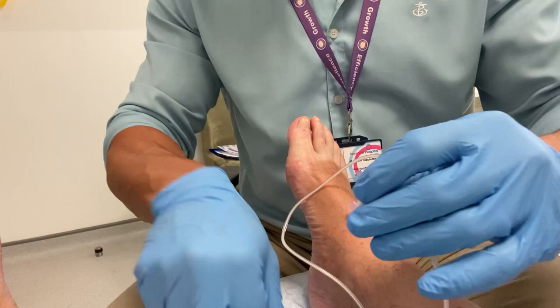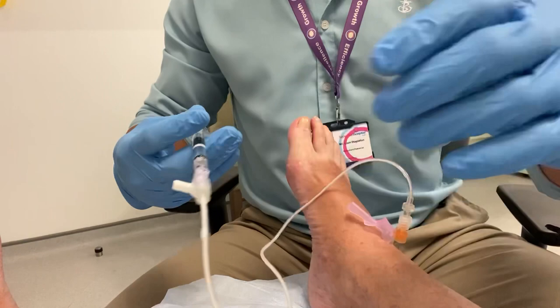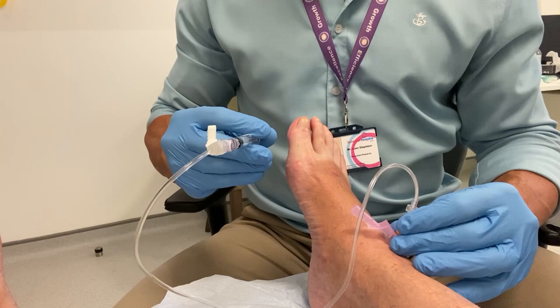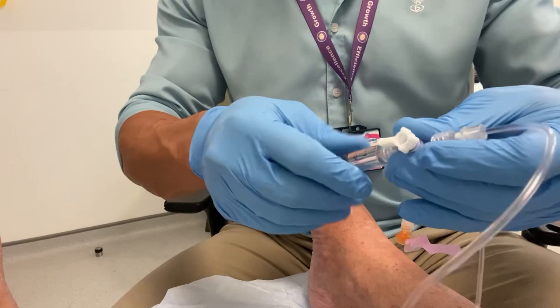We have some local anesthetic and corticosteroid injected first. Then here I'm beginning to fill the tube with the hyaluronic acid using the brand Ostenil, which is my preference. I like to use a connecting tube for these, as it certainly makes the injection slightly easier.